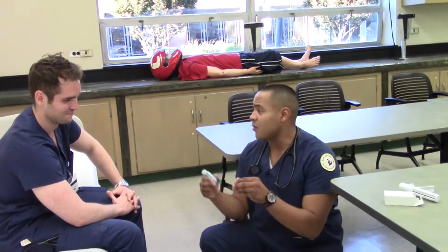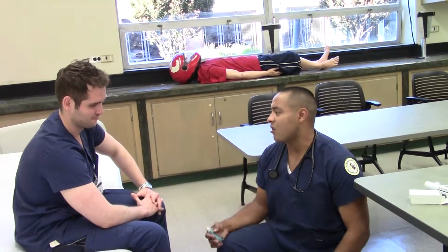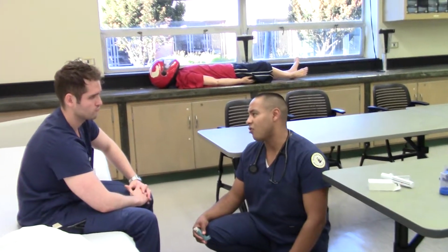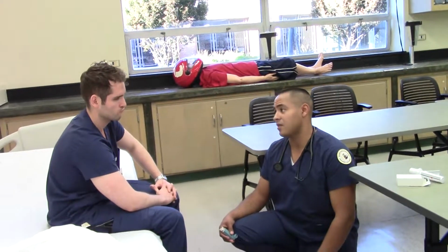So this is albuterol. Once you get it, side effects are it's gonna make your heart pump faster. Okay, it's like having coffee. So your pulse will go up, blood pressure, your pulse will go up. It's fine. It's normal. Okay. I'll be monitoring your pulse throughout the whole thing. Okay, that's totally fine.